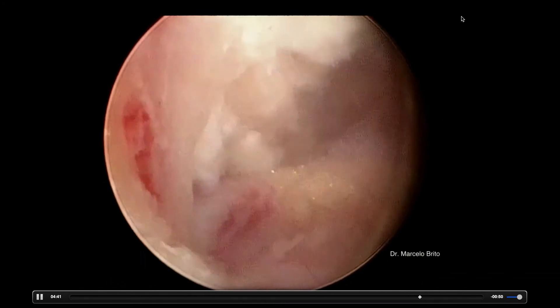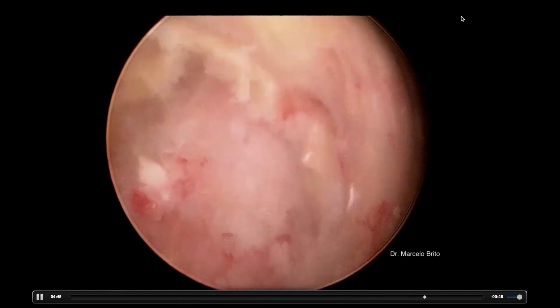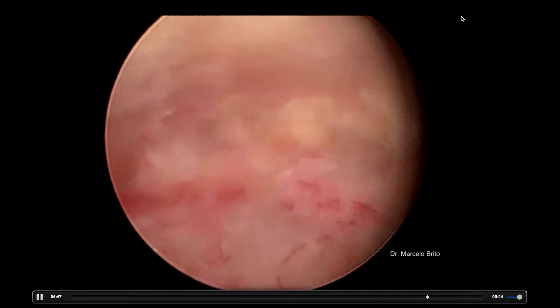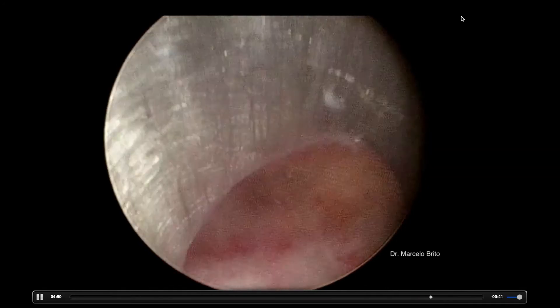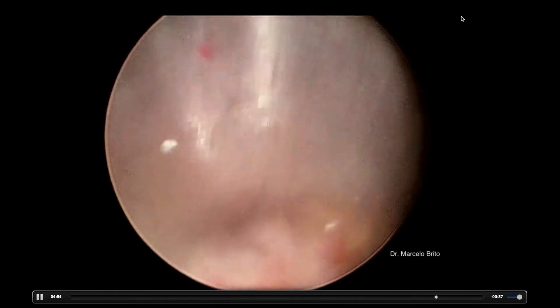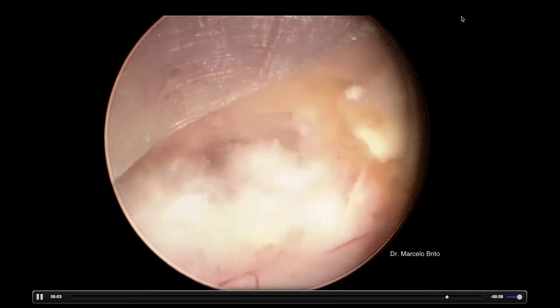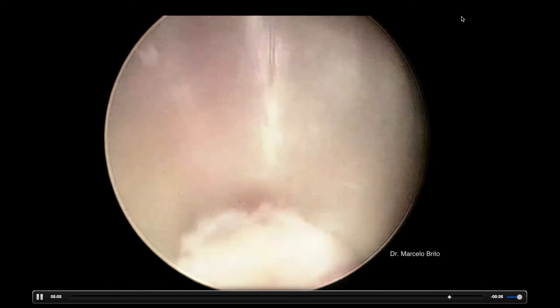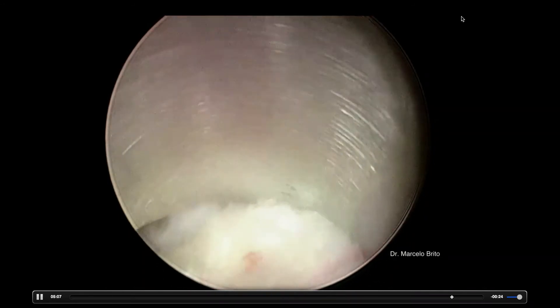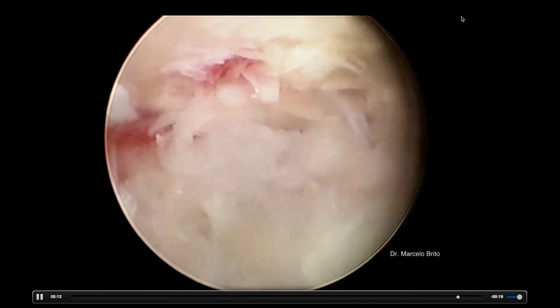Now we see the top of the canal. We're seeing the ipsilateral side, then progressing to the contralateral side with the cannula. A thinner material helps you to get inside the canal — if you have a thick material, you just can't do that. With a thinner material, we can get in, check the disc on the other side, check the foramen on the other side, and work with much more comfort.